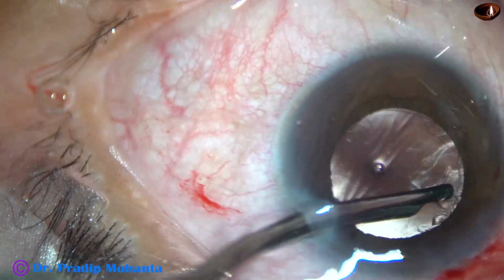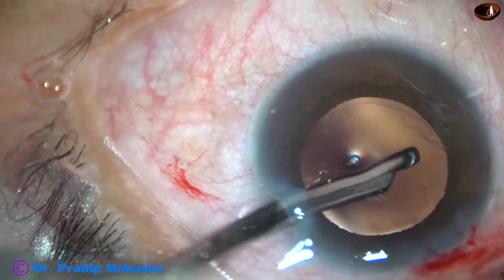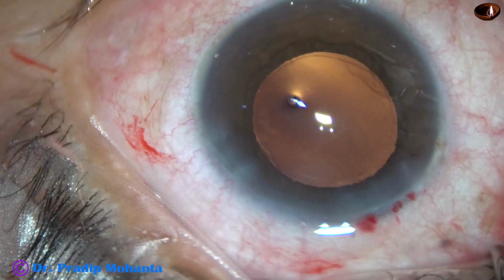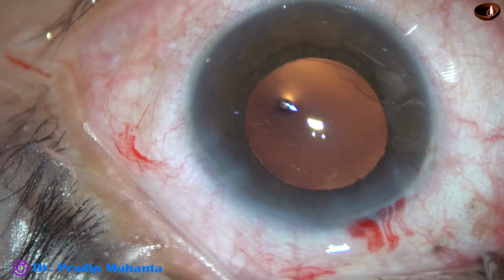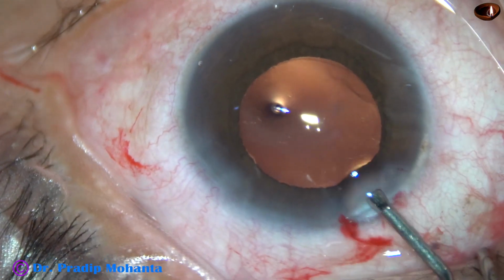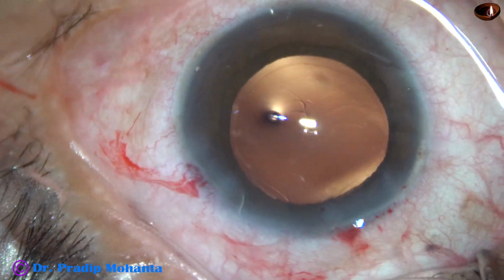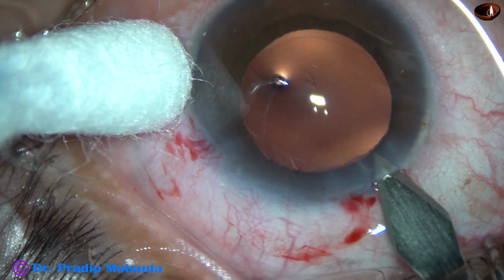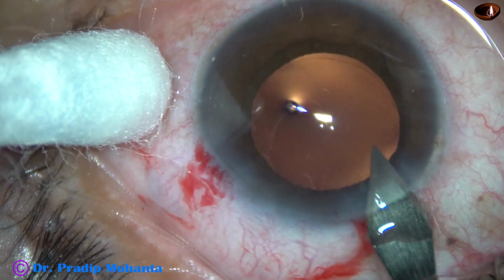We have only one side port. So if we want to use bimanual, we have to make one more side port. And now visco again to fill up the anterior chamber, and then the main wound is enlarged to about 3.2 mm.